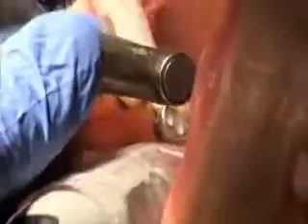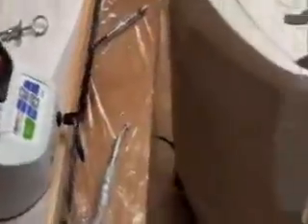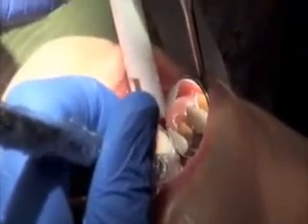The crown and the decay were then removed. Notice the isolation mechanism at the bottom of the screen. This isolation mechanism helps evacuate the mercury vapor from the old amalgam filling that the old dentist had left underneath the old crown.